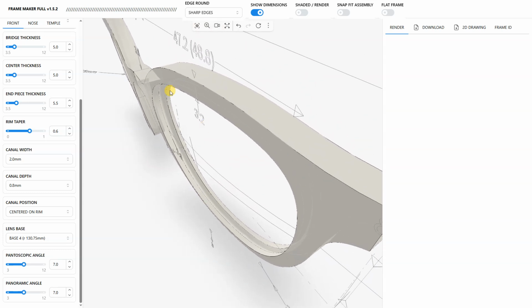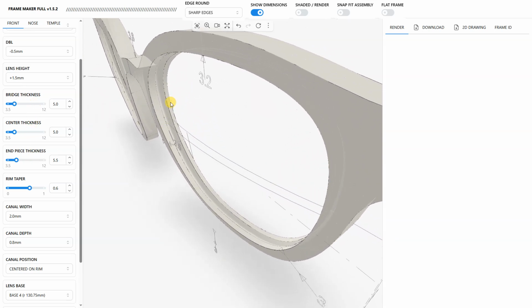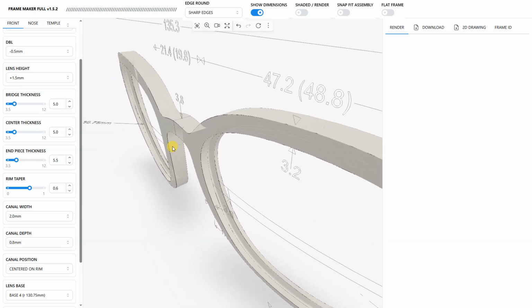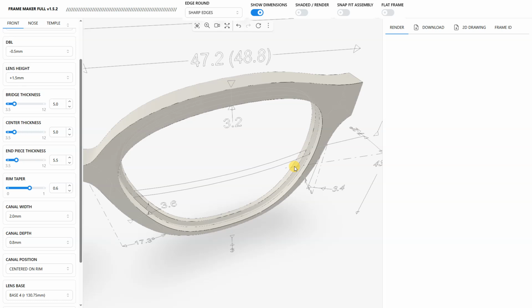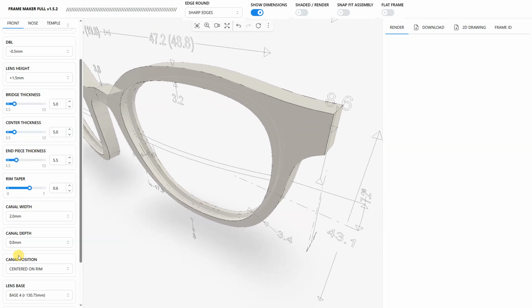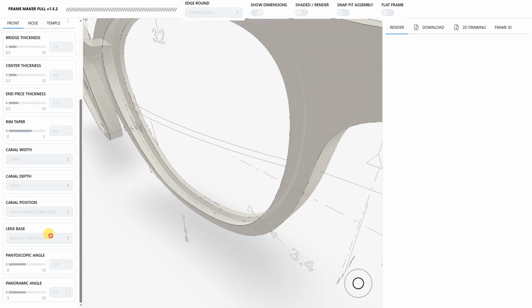Now this is tricky. For one, because the rim thickness is changing with the thicknesses that I specified up here. So we are going to have some variation among the bridge. Also, if we consider that we're adding a bridge bump, that's also going to alter this thickness. These are all things that happen when someone works on a frame, be it for 3D printing or even an acetate. After this is molded, this is heat bent, and let's say the nose is bumped. All of these thicknesses start to change, and that is somewhat reflected here in 3D. So, for example, even the rim taper alters that thickness here at the bottom. So that's why the canal position is kind of tricky. And for that reason, I added something here like, for example, 0.8 from the front edge. I know that the front edge is, I can take that, use that as my reference.